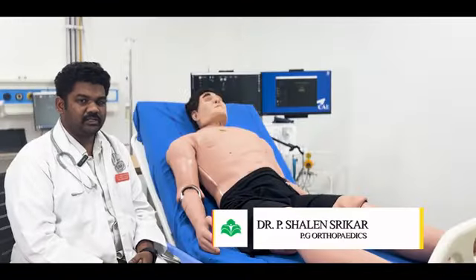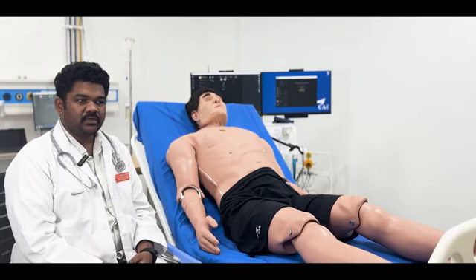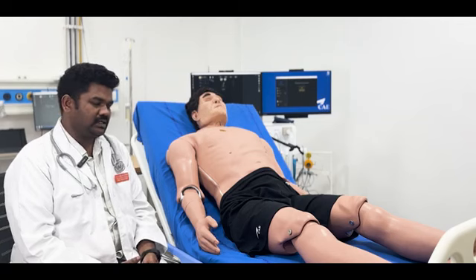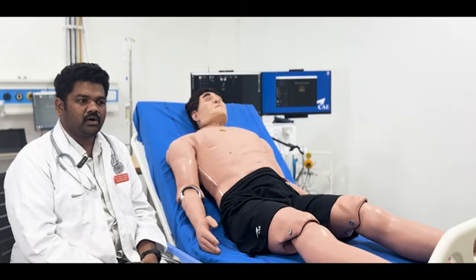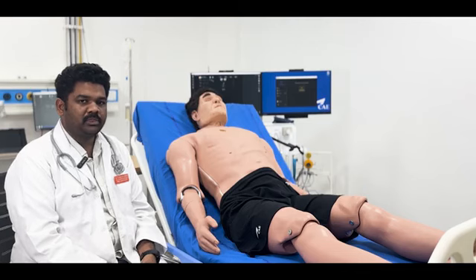The skill lab right now in Prathima is a very innovative, very replenished, very renovated place which is thriving to take us ahead in our real life scenarios. The lab itself has a lot of mannequins which can portray the real life scenarios where we can put our medical skills to practice and become better. The skill lab is like a dream come true, and we have an ultra modern Apollo mannequin and a simulator on which A to Z of all the clinical case scenarios and situations can be learned, practiced, and also assessed.